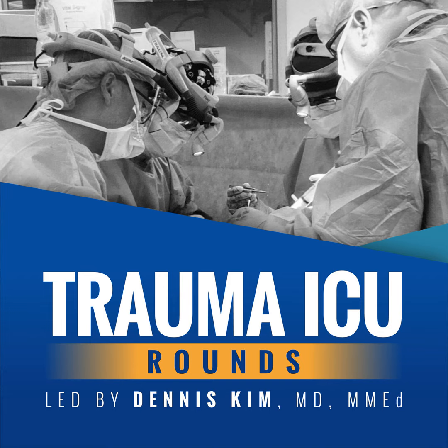Also, every breath is a mandatory breath in CMV, whereas in AC, if the patient triggers a breath, these are assisted, but the same tidal volume as every other mandatory breath. Now, can you imagine any downsides to using AC as a mode of ventilation?